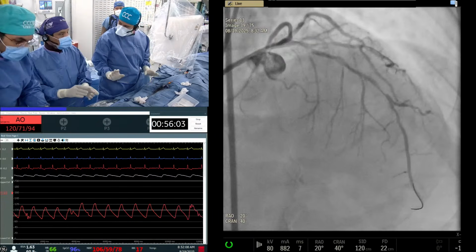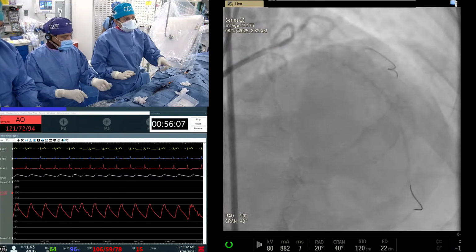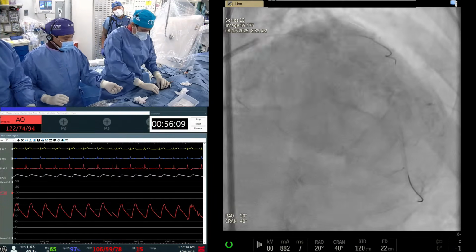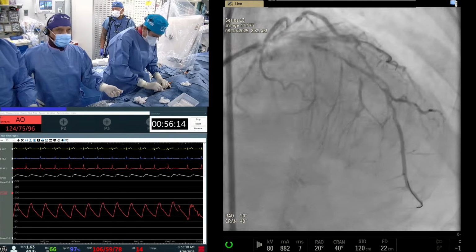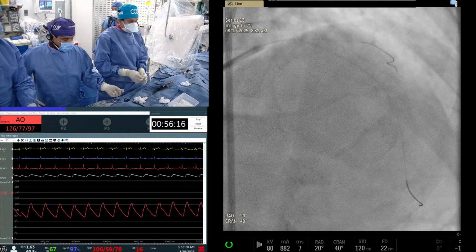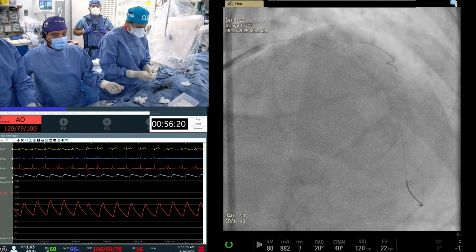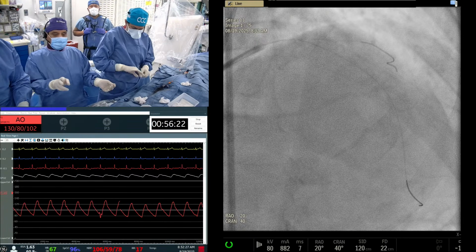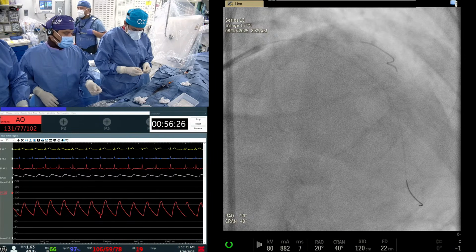Why side branch? We are going to do the distal. Okay, let's do first the distal, which is the 2.5 by 30, and then proximally we do a mini crush. You mean distal LAD? Yes, distal mid of LAD. So mid distal of the LAD and proximal lesions. So we'll call it a proximal LAD with a D2 bifurcation and mid LAD. So 3 lesions we are dealing with.